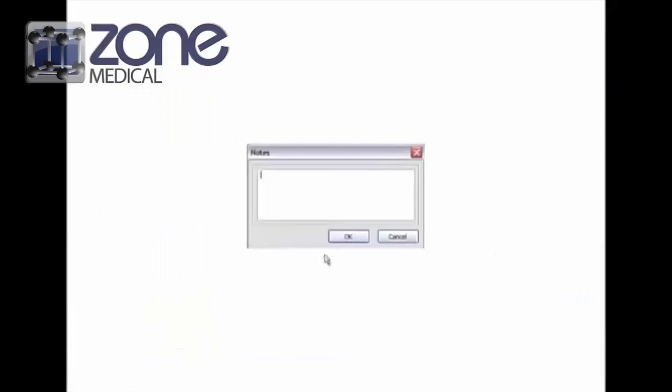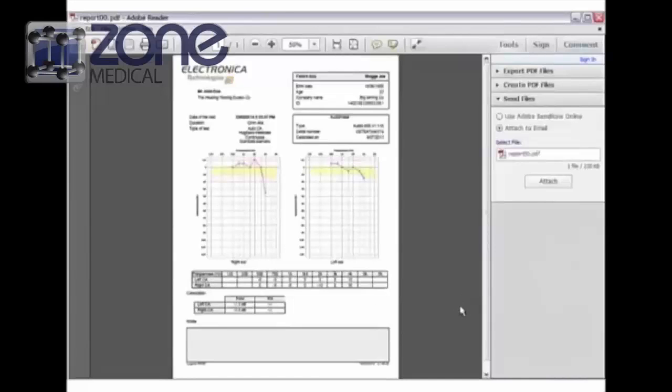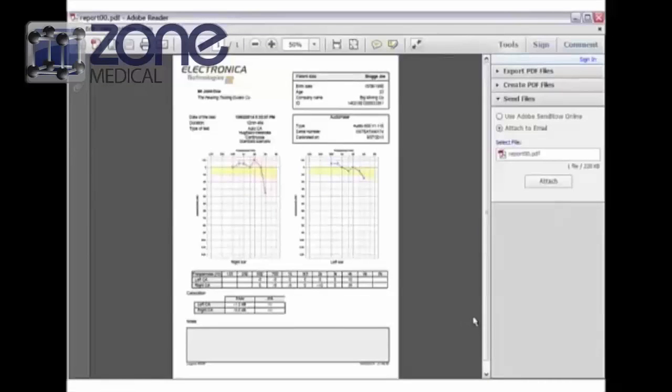You also have the opportunity to add notes if necessary, and these will appear in the report. You can then print by selecting print, or you can export the file to save the report to the PC.